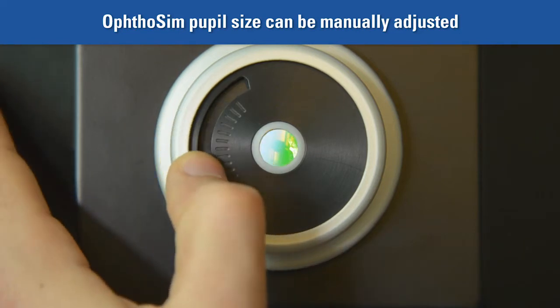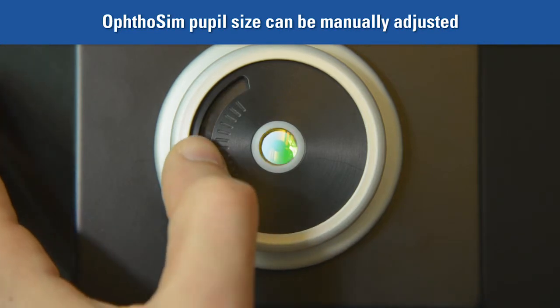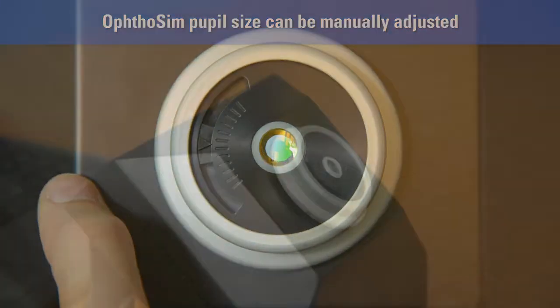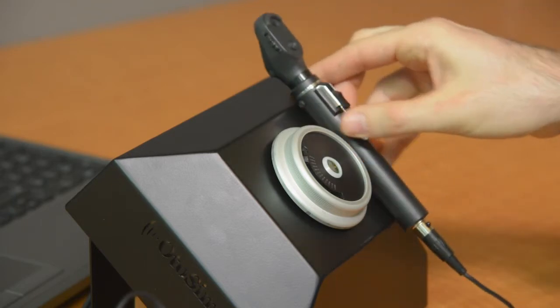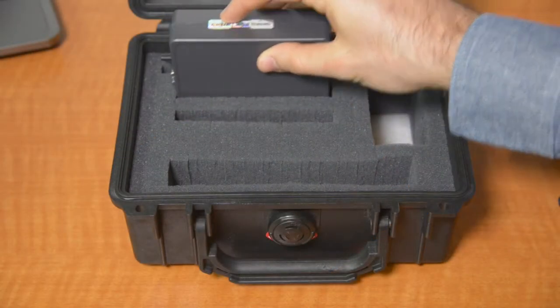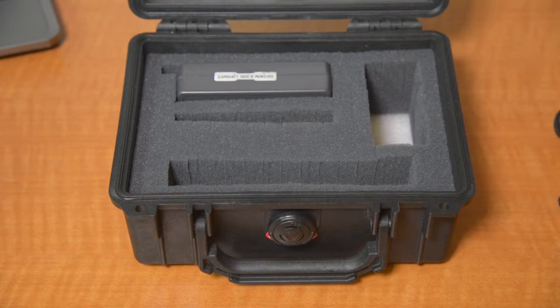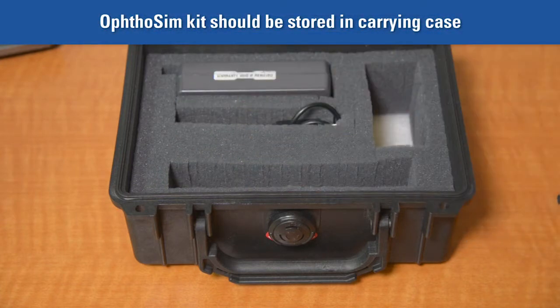A larger pupil size will increase the amount of light entering the unit, thus making it easier to view the retina. For this reason, we recommend using the largest pupil size when first starting out. When not in use, place the ophthalmoscope to the side of the eyepiece on the base unit — the magnet in the handle of the ophthalmoscope will hold it in place. When storing, the components of the OphtoSim should be put in the case provided, as the sensor box and ophthalmoscope are both very fragile.